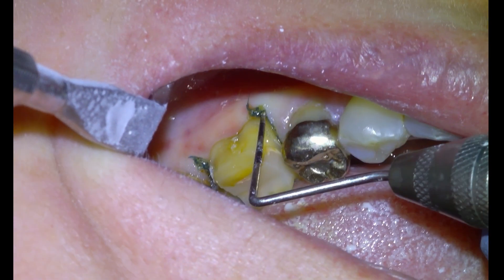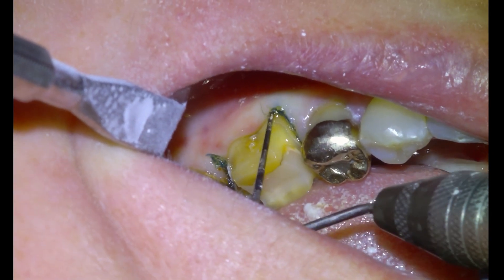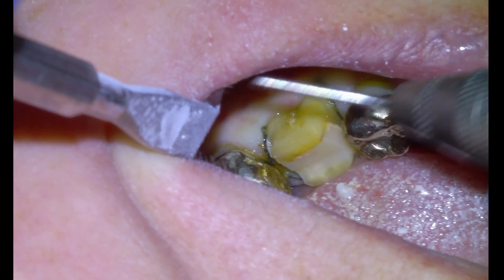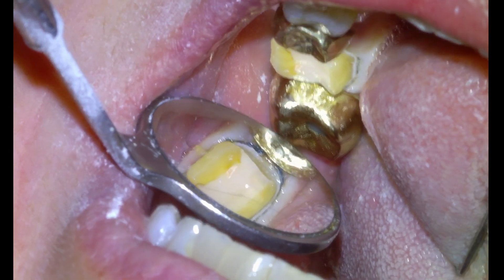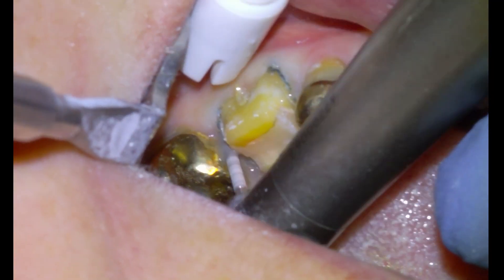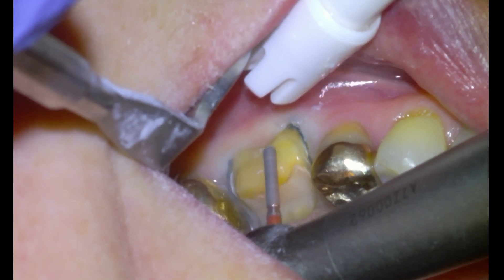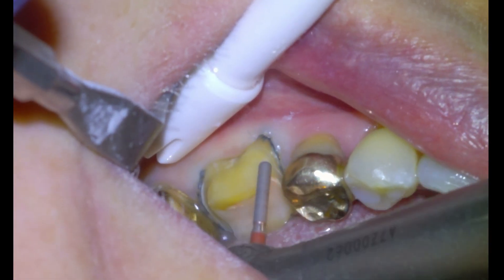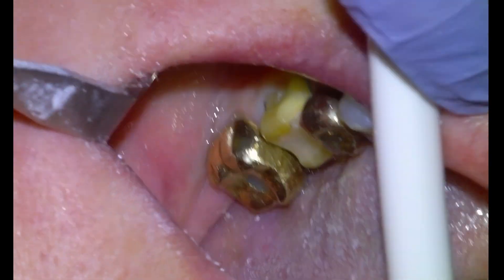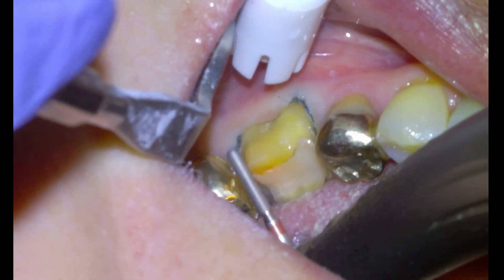We're just going to tuck in the rest of the cord and then we're pretty much ready to scan, but we'll do a little bit of refinement with a fine grit fisher burr. I follow Marcus Blatz on Instagram and he references literature saying that if the surface of the prep is smooth, you'll have a better fit of the crown without compromising retention. I'm going to check the buccal cusp reduction, maybe take it down a little bit more, and ensure there's at least one millimeter everywhere on the clearance map.